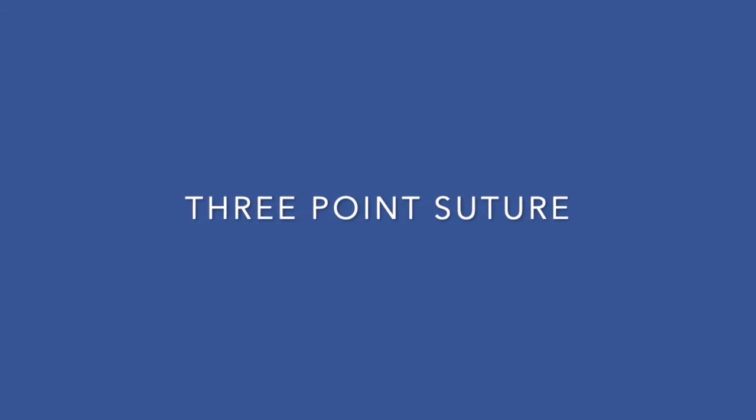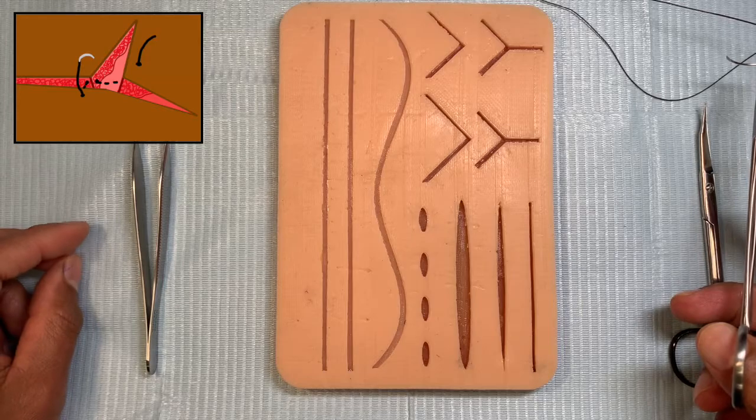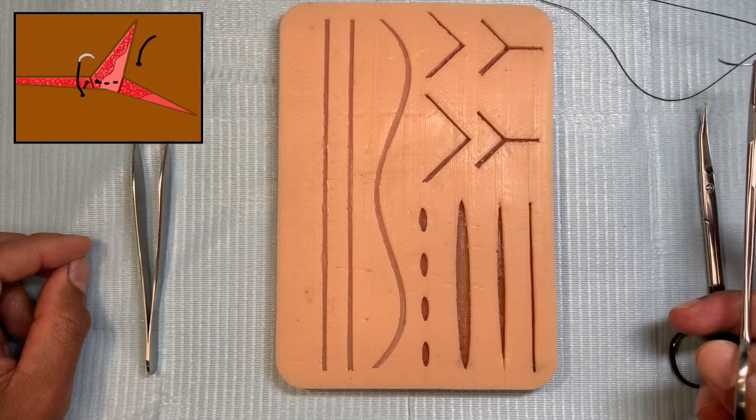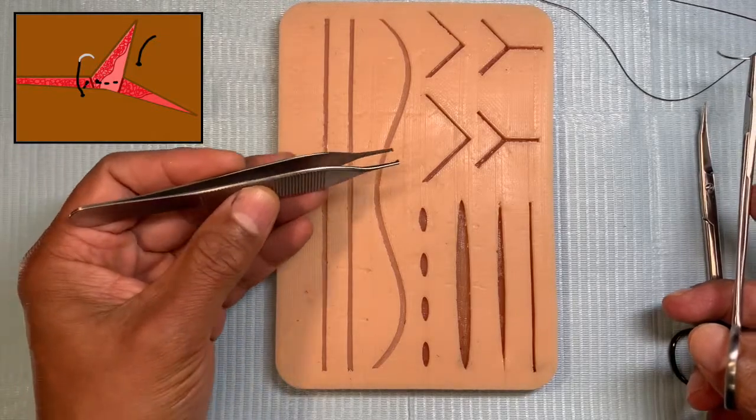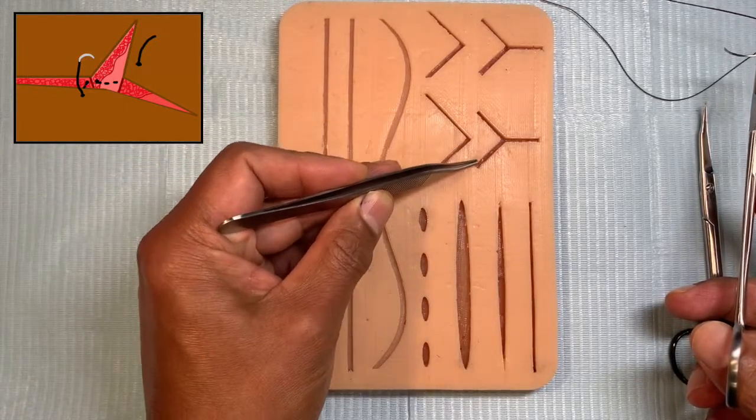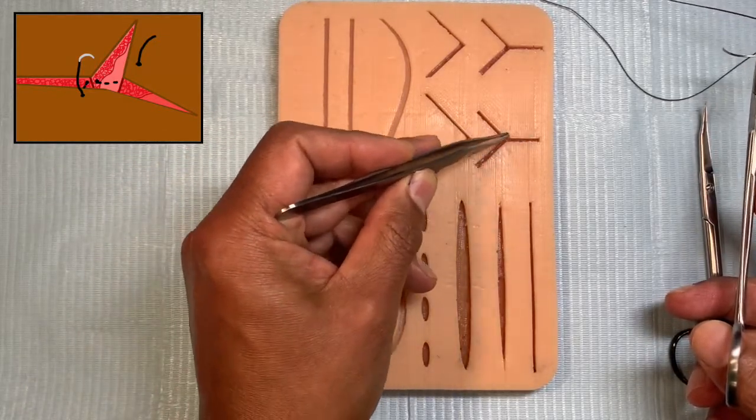This video is about the three-point suture. Wounds don't happen in a linear manner very frequently and you have got sort of junctions. So you can see in this demonstration pad this is a three-point or there may be irregularities like these.